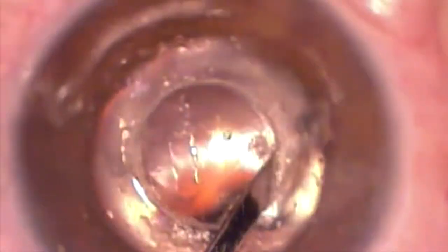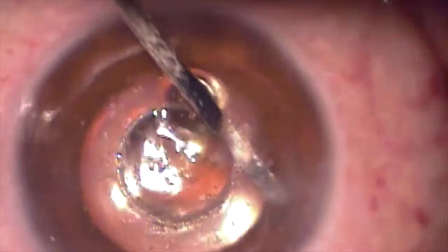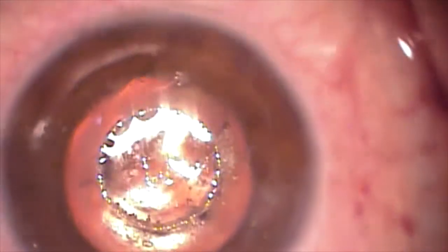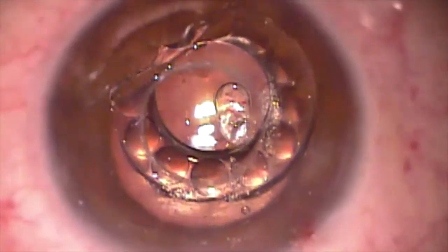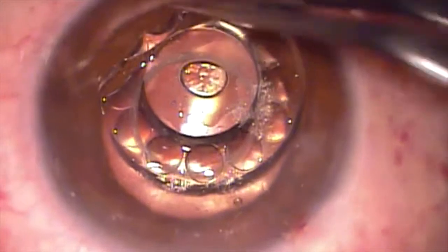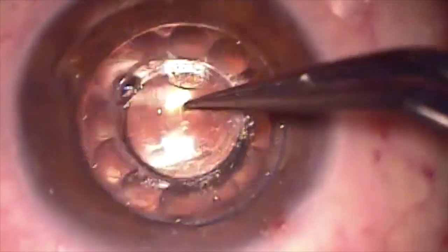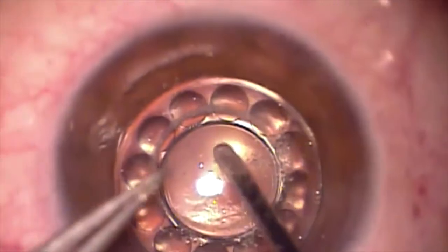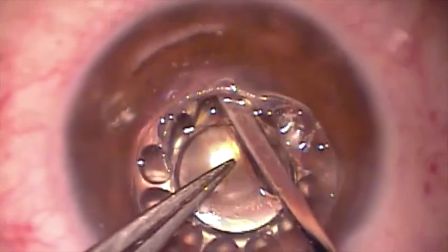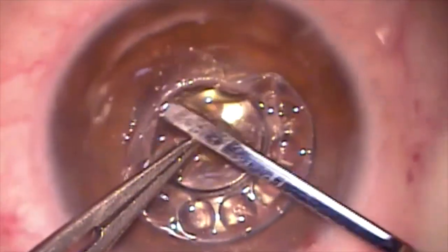A blunt spatula is then used to sweep the recesses of the corneal pocket to make sure there are no adhesions. The Caraclear XT artificial cornea is then brought onto the operative field using blunt forceps. A blunt spatula is then used to tuck the skirt of the Caraclear XT into the recesses of the corneal pocket.